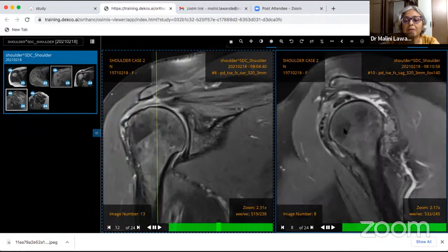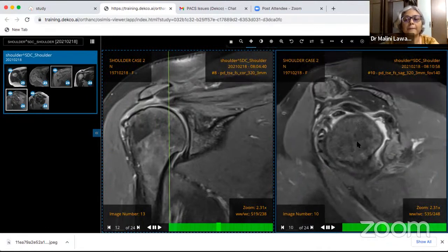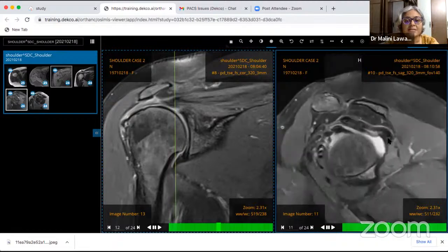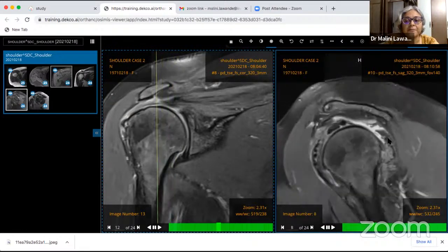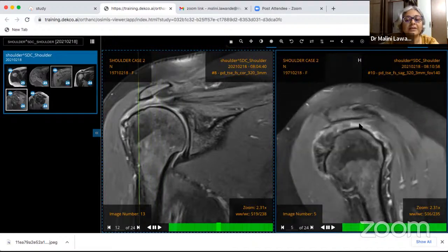Yeah. So we trace from here. This here is the supraspinatus. This here is the long head of biceps tendon. This is subscapularis and this is infraspinatus. So as I come more laterally, you can see the supra and infraspinatus tendons stop here. There is no supra and infraspinatus tendon except for these few anterior supraspinatus tendon fibers which show severe tendinosis. This is the subscapularis tendon here.